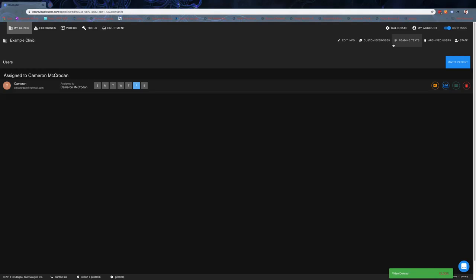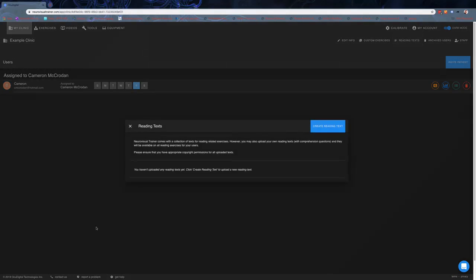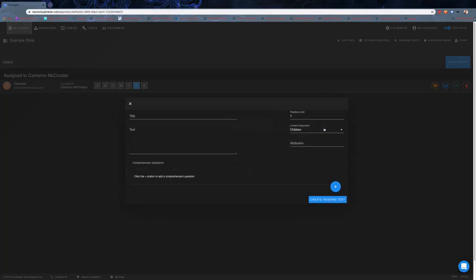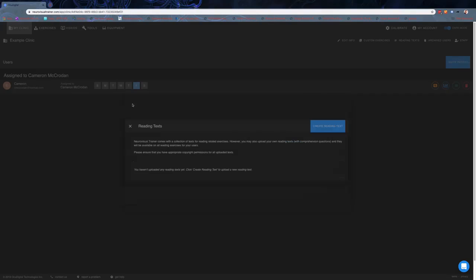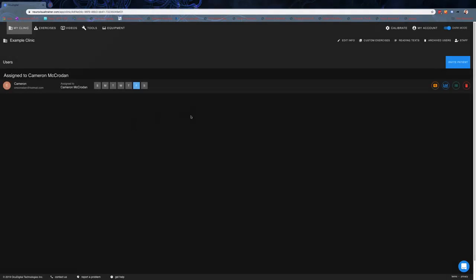The last custom thing, which is super handy, is the reading texts. With NeuroVisual Trainer, we can upload and create our own reading texts. You can put in a title, the body of the text to be read, add the comprehension questions, choose a reading level, choose whether it's adults or children, and for attribution you can say where that reading material was sourced. There's some pre-loaded reading material, but that's a really handy way to add custom stuff for people to be able to add articles they want to read.